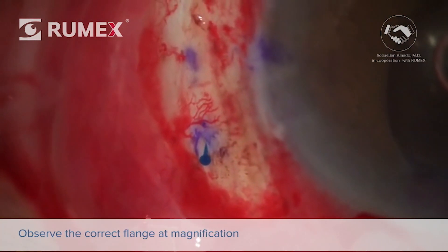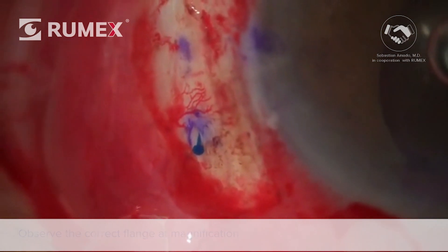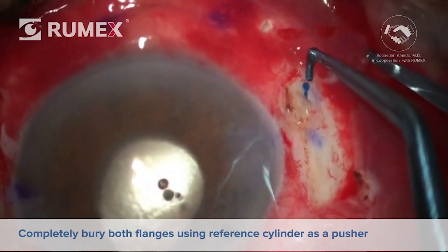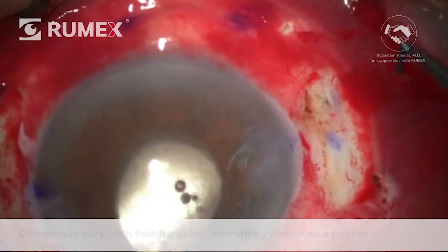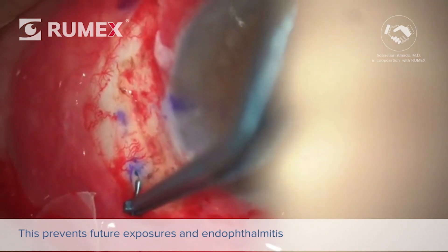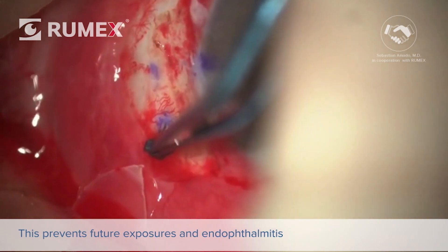Observe the correct flange shape and size at greater magnification. Finally, a very important step is to completely bury both flanges using the reference cylinder as a pusher. This will prevent future exposures and theoretically lower the risk of endophthalmitis.